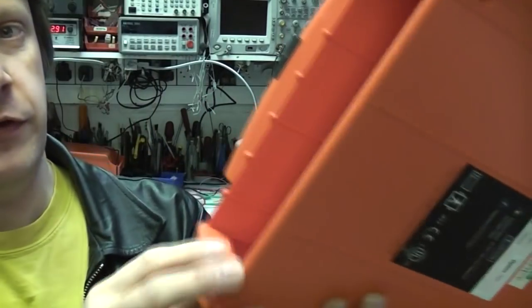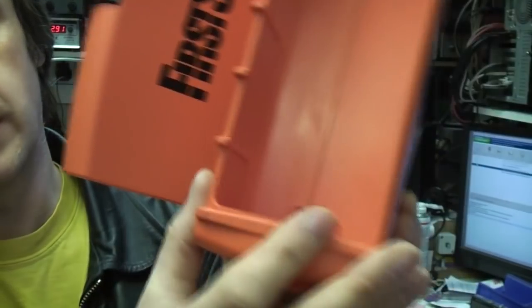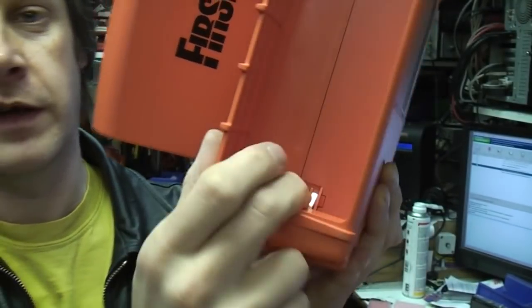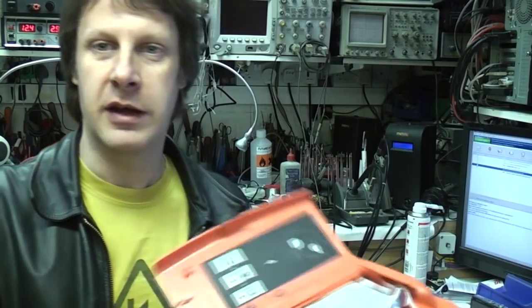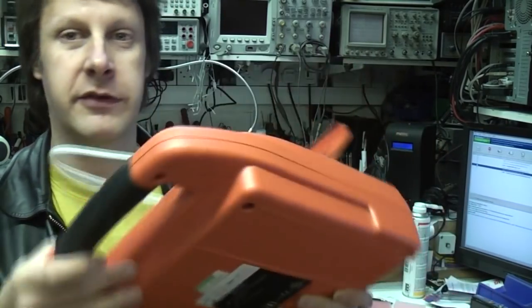The battery has actually got in this, it's an intelligent battery. You've got these four contacts here which is a data link so the battery can provide information about how many times it's been used, what its charge state is, what type of battery it is. I'm sure also just to avoid third party batteries being used because you don't really want to find you've got some dodgy Chinese battery that's not going to work on a piece of equipment like this.